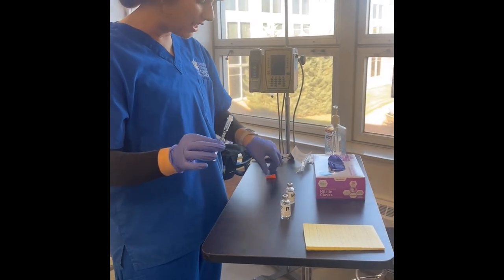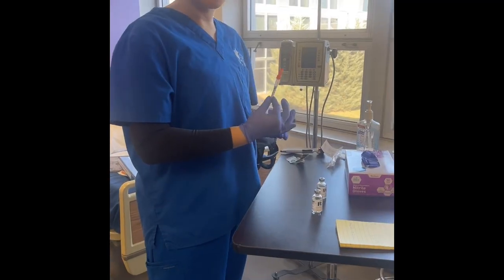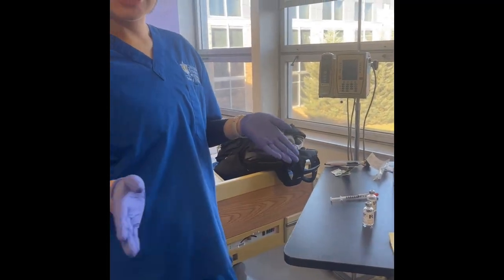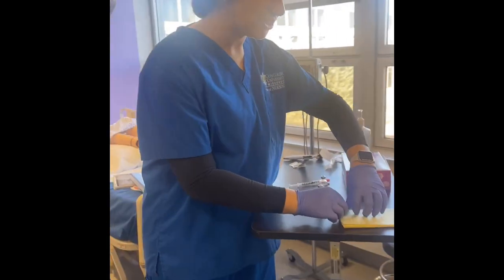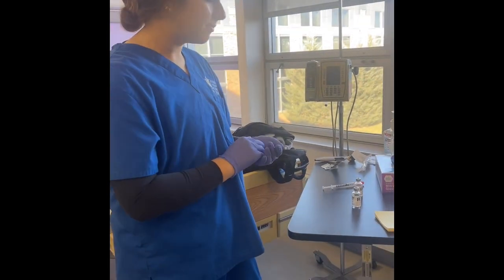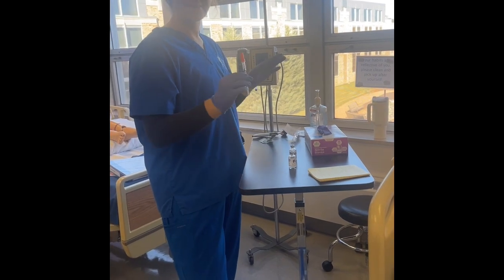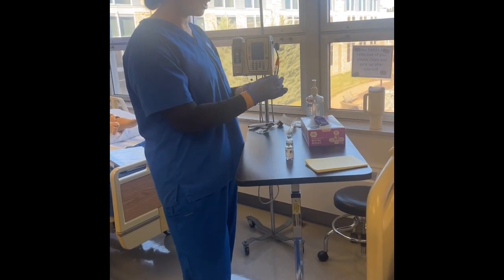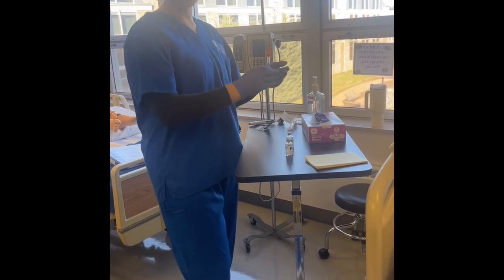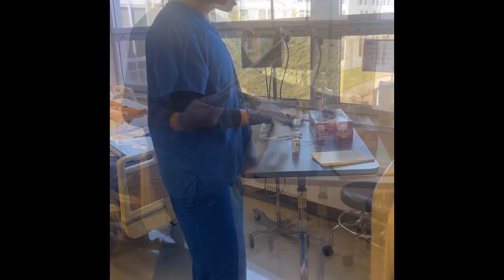Now we're going to recap the needle. Perfect. Now we have our insulin. We unfortunately don't have any labels, but you would want to label it with the amount and your name. Then I'm going to get another person, and we're going to check the insulin to make sure we have the right dose.